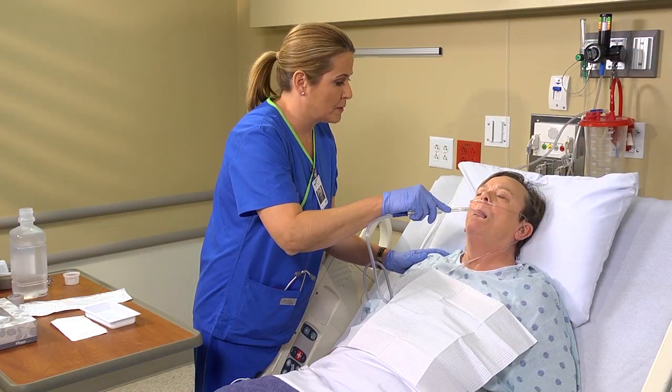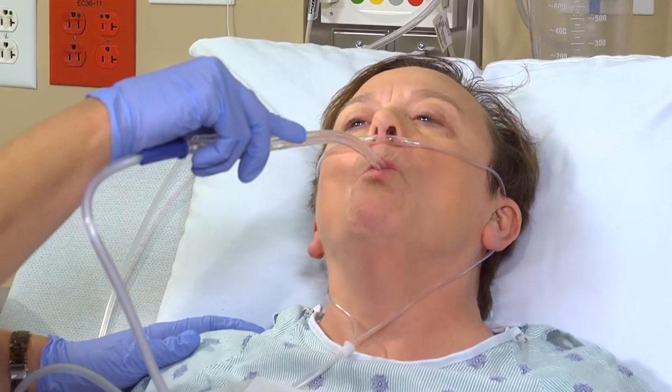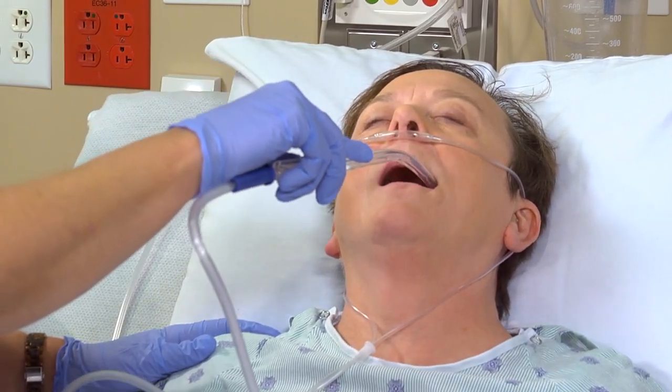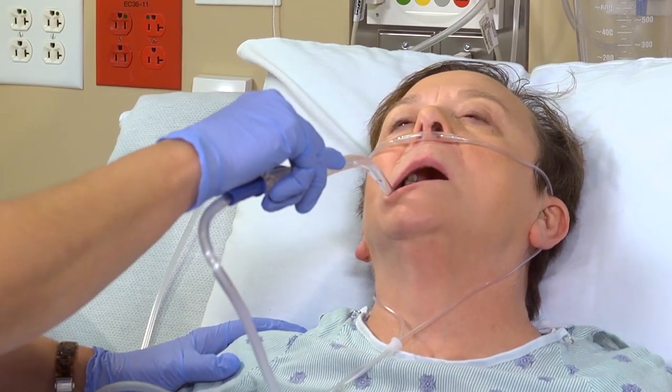Insert the catheter into the patient's mouth, moving along the gum line toward the pharynx. Apply suction and move the catheter around the mouth until all secretions have been cleared. If the patient has an oxygen mask, replace it.